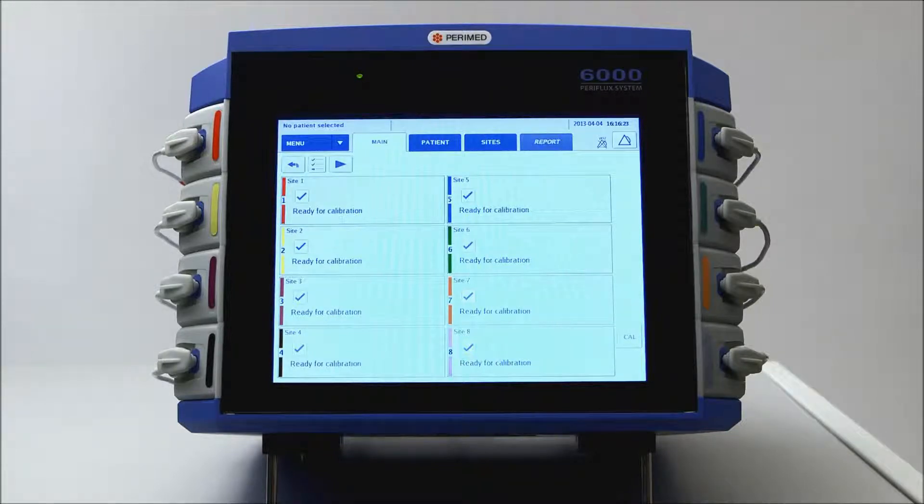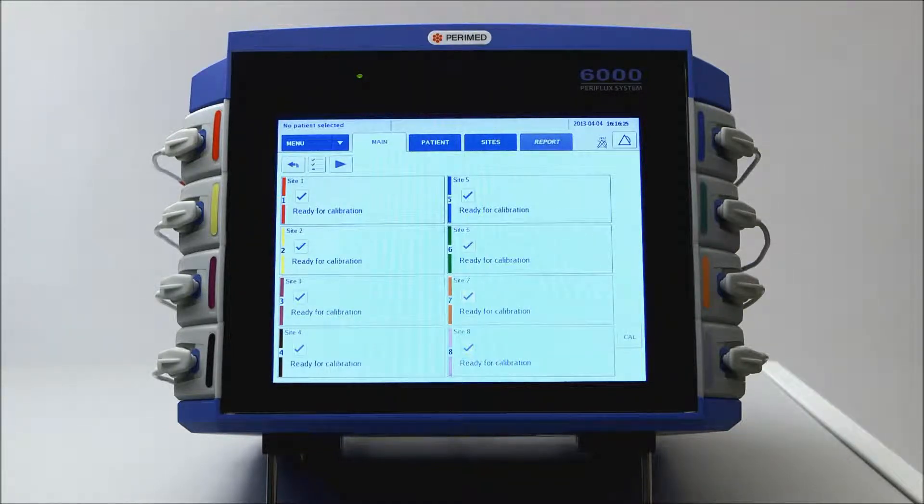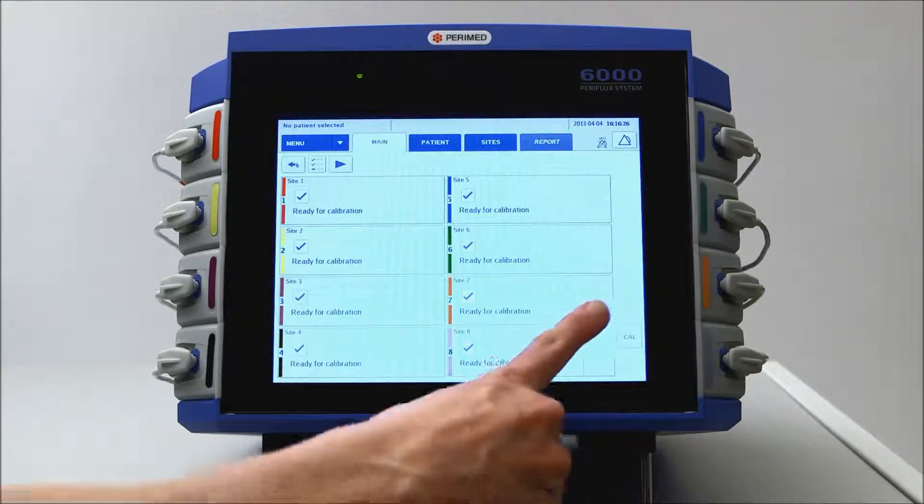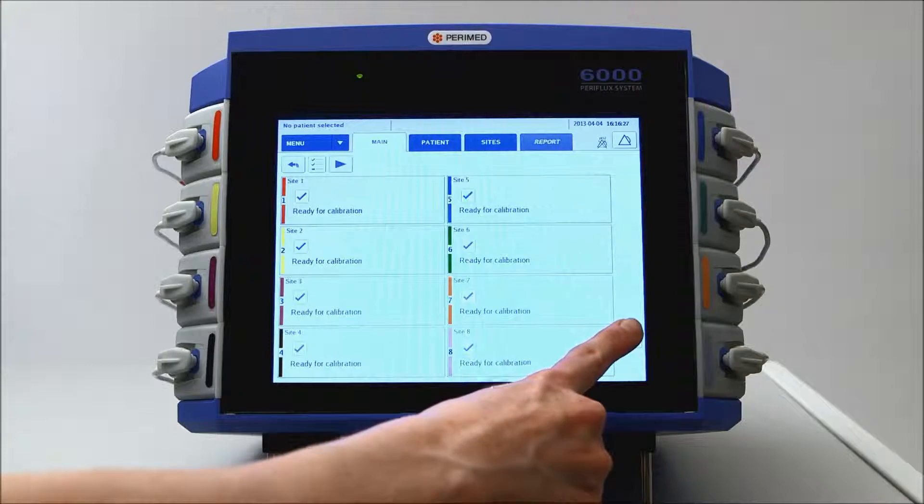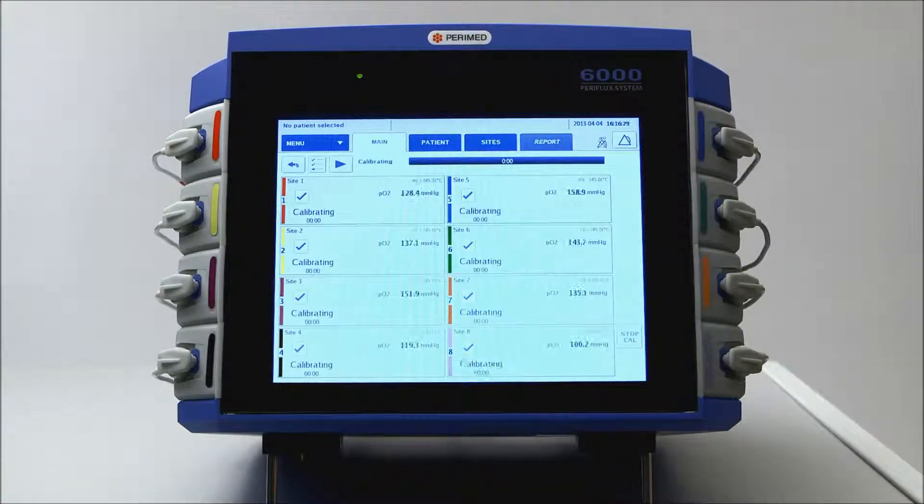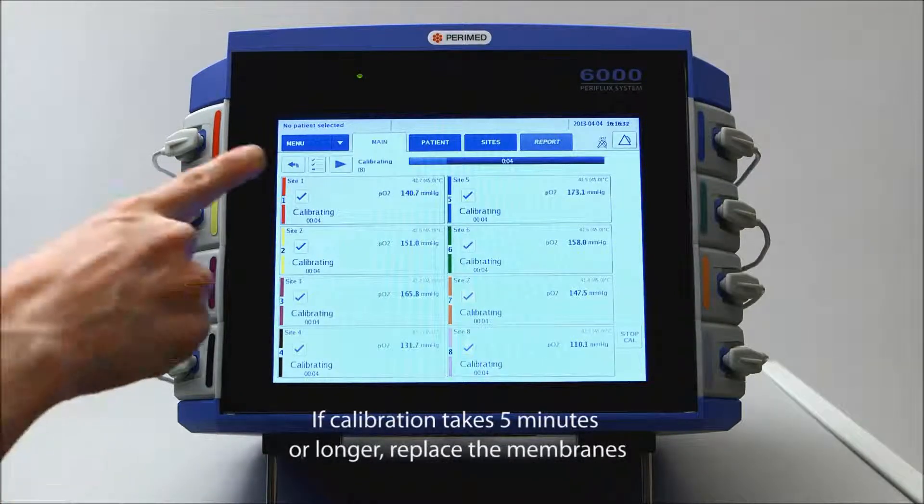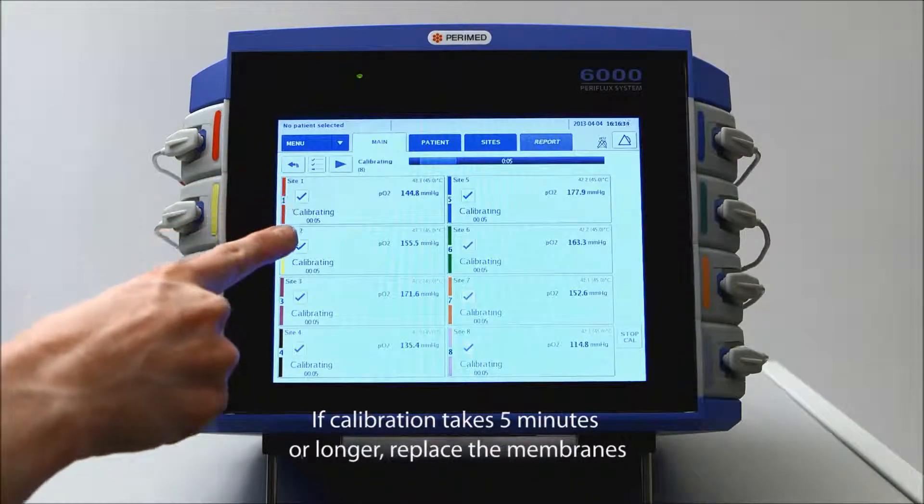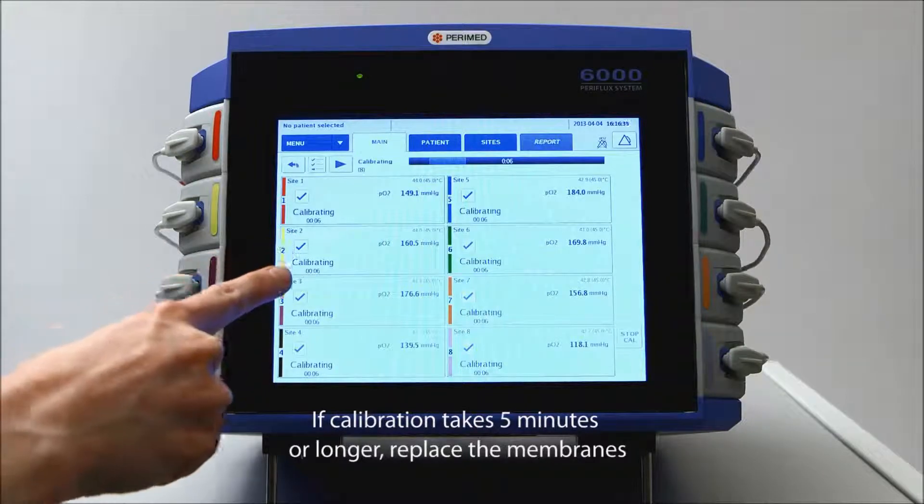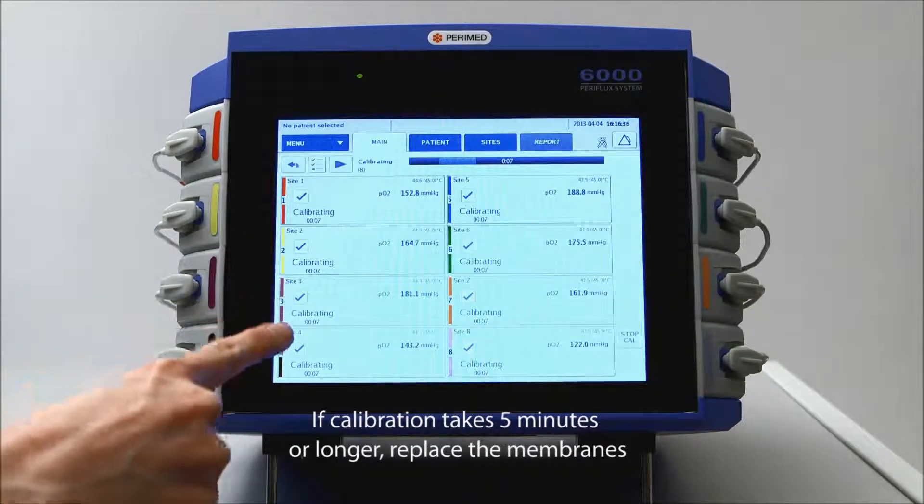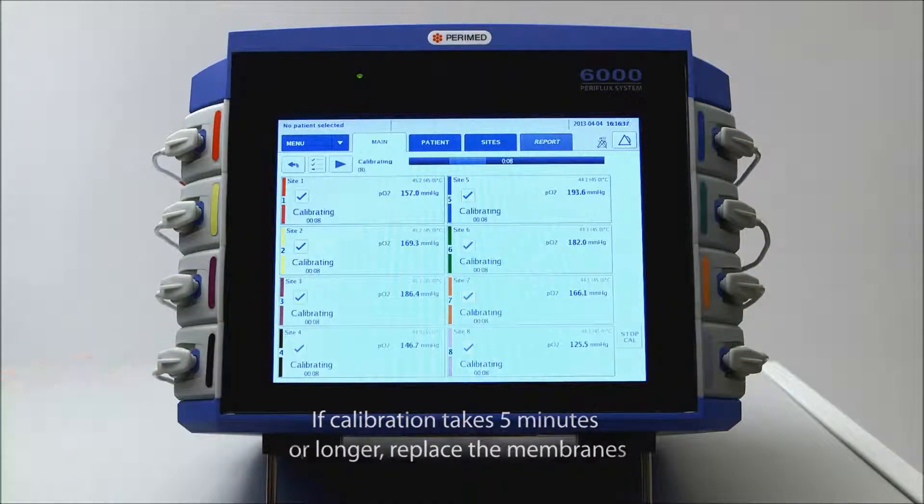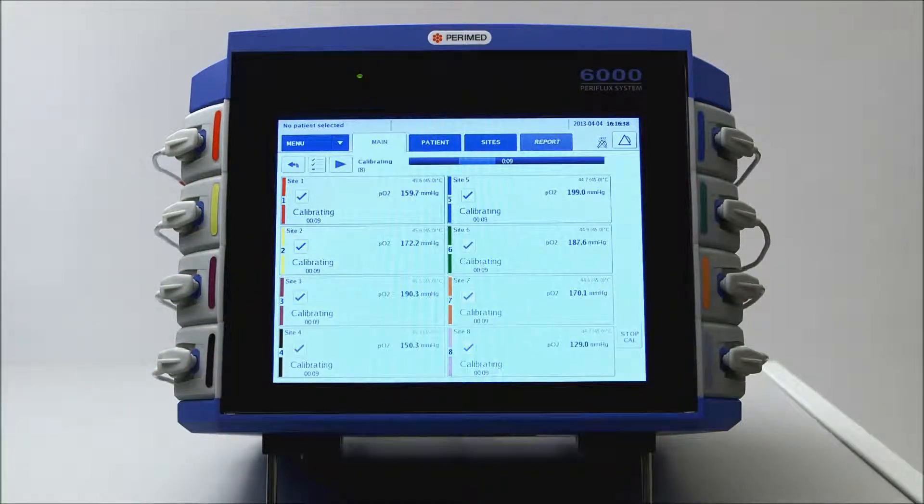See the manual for further information. Calibrate all the electrodes by pressing Cal. This should take only a couple of minutes. To calibrate specific electrodes, simply check or uncheck them.